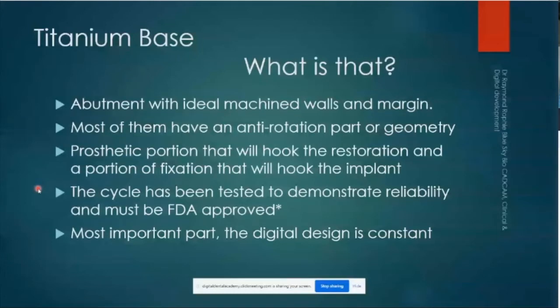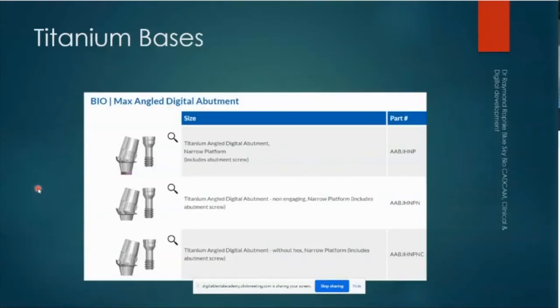However, as with everything in digital dentistry, as with everything in dentistry actually, it is user dependent. So if we know how to use the parts accurately, and we know all the necessary parts for this to be an accurate and successful restoration, then we can be sure that our treatment will have a long-term prognosis and be successful for a long term.